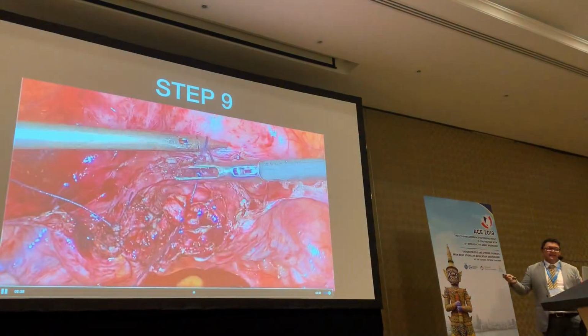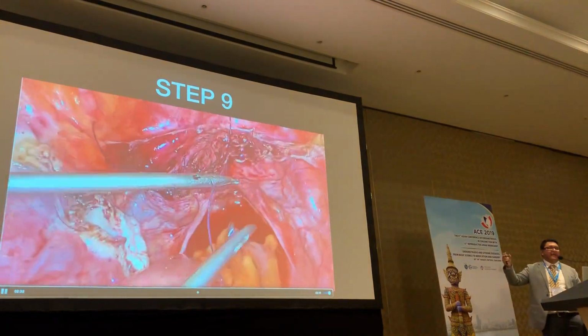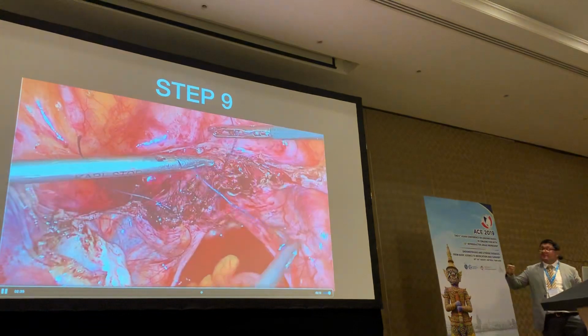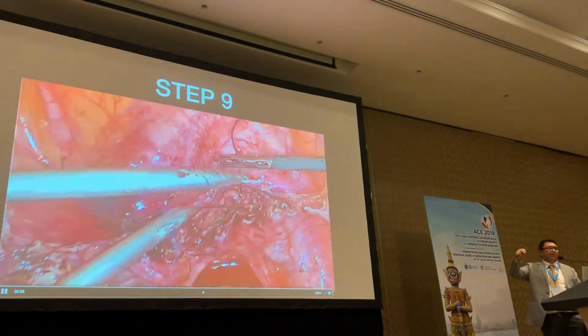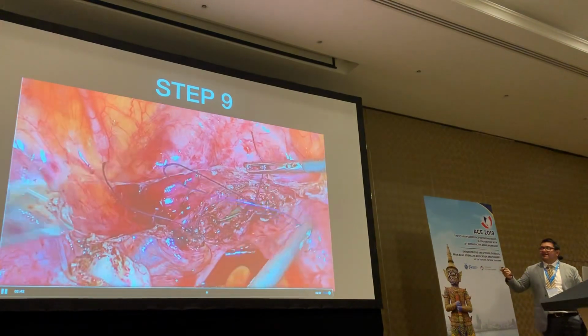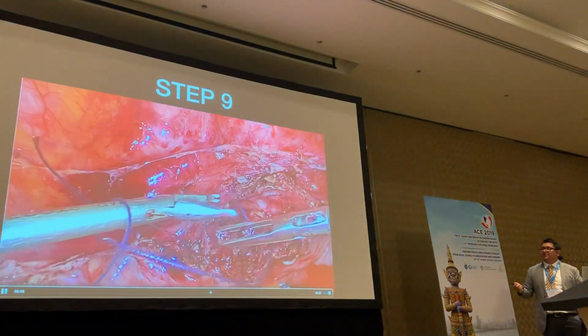So you should be hemostatic. It's important, you have a healthy oozing at the vault, so don't go and camp on the vault with your bipolar, because then you're creating necrosis and ischemia there, which is not going to heal, and it's going to cause big problems.